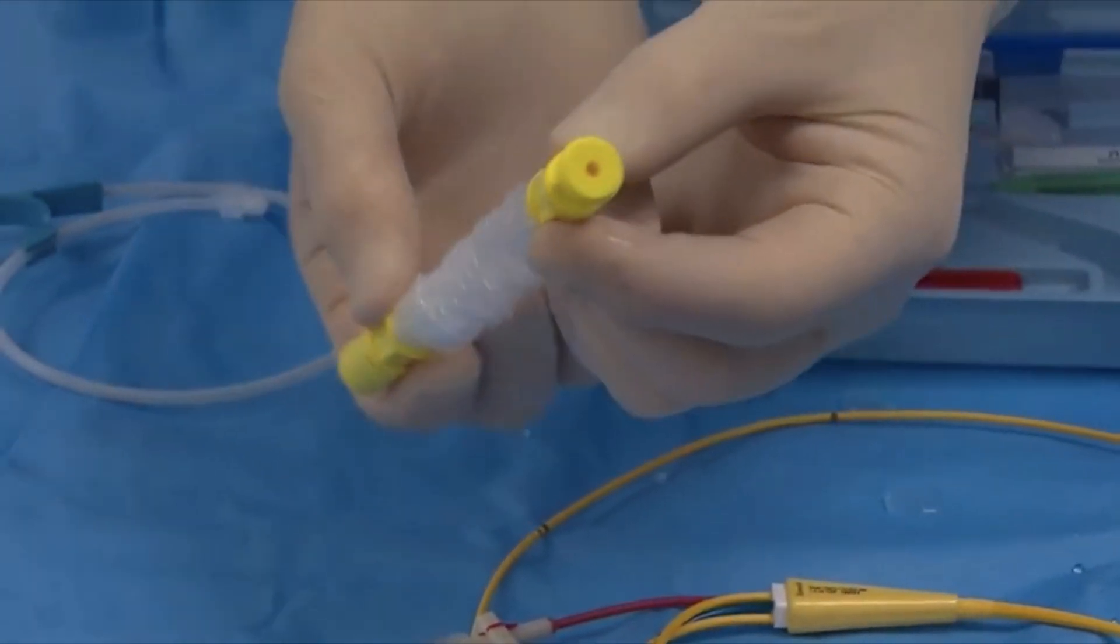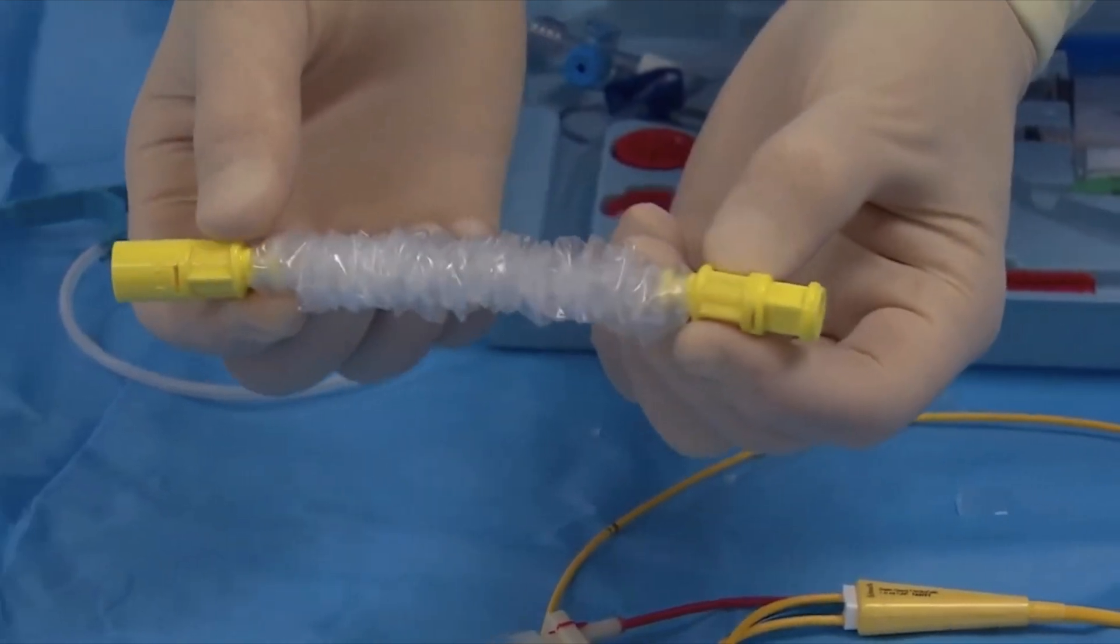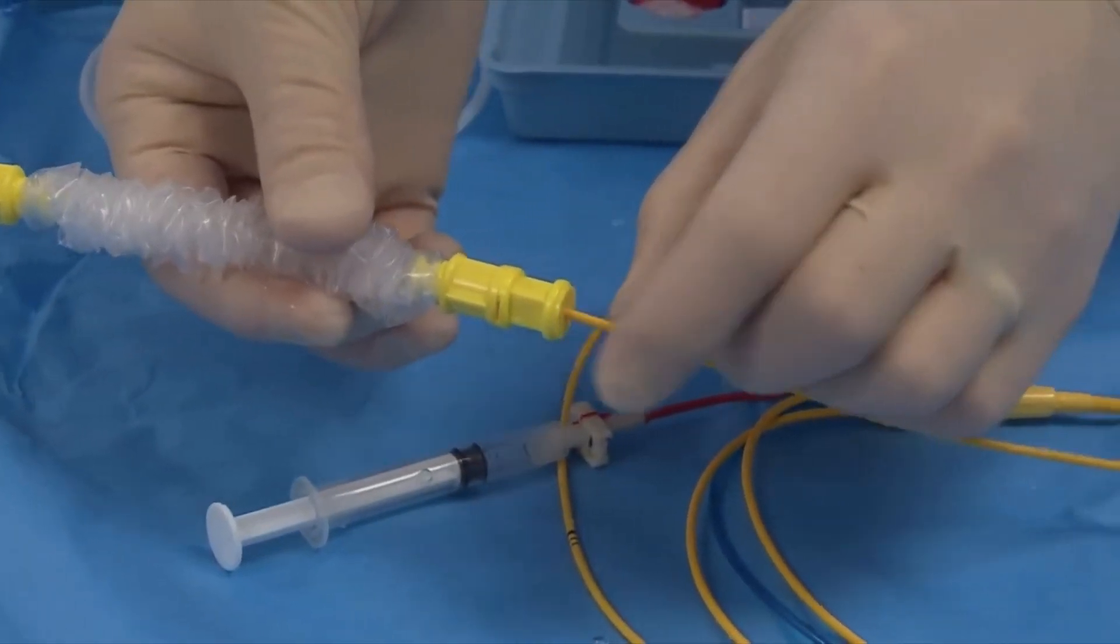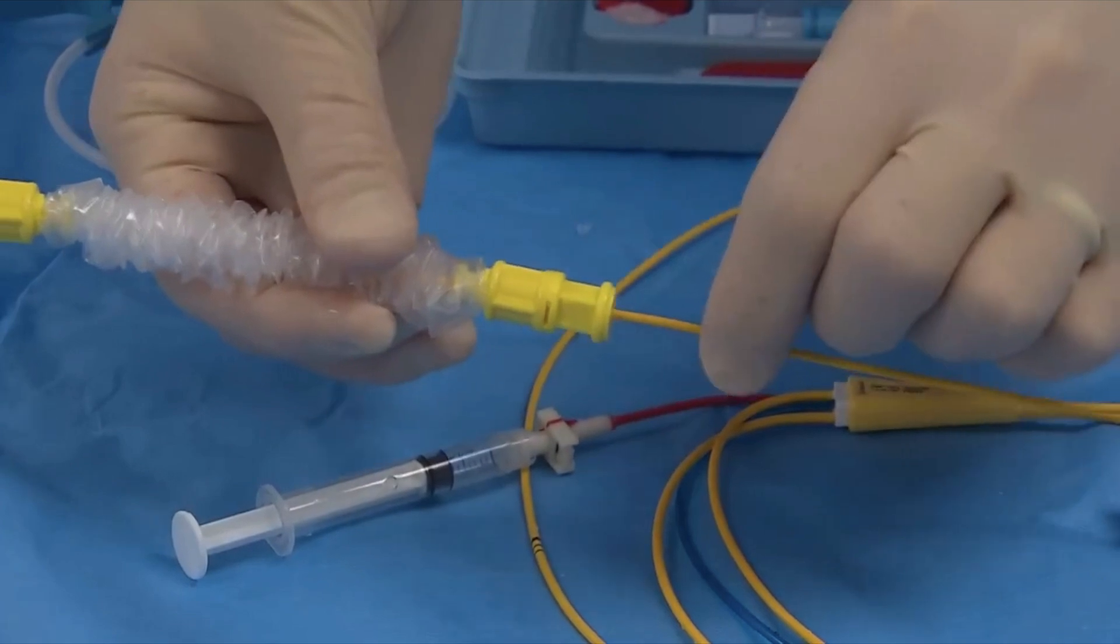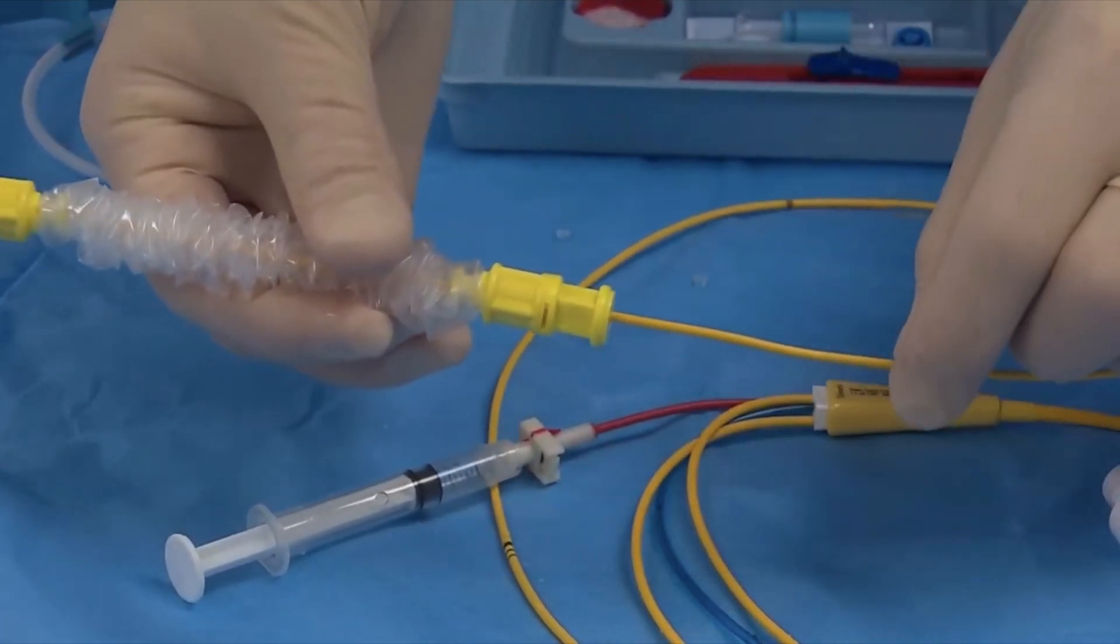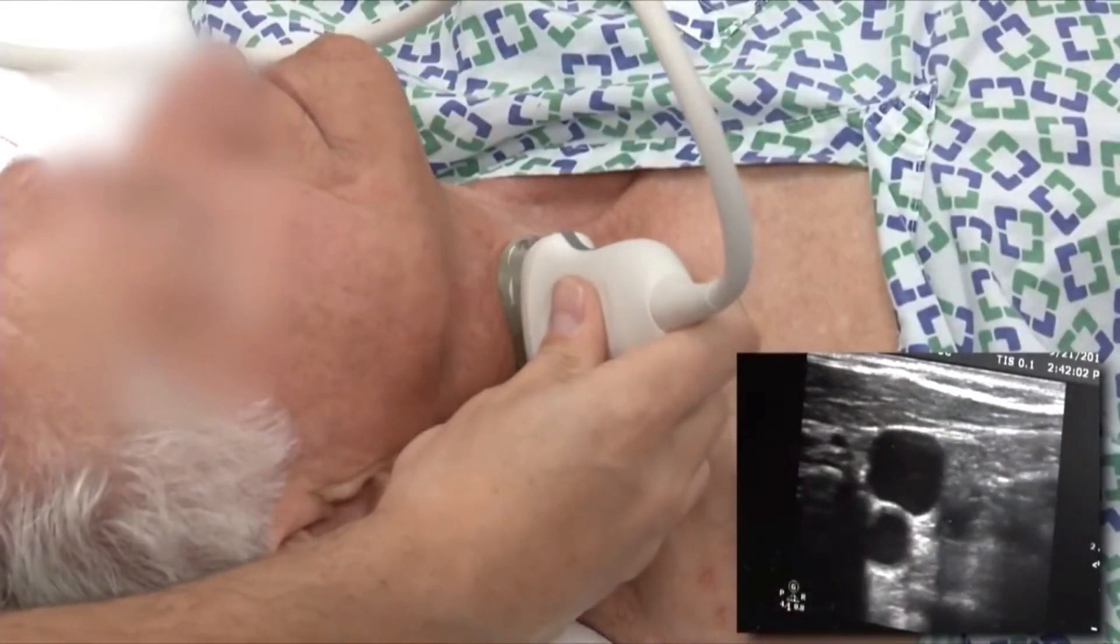Swan-Ganz catheterization is performed to evaluate heart failure, heart function following a heart attack, shock, pulmonary edema, or fluid in the lungs, congenital heart disease.